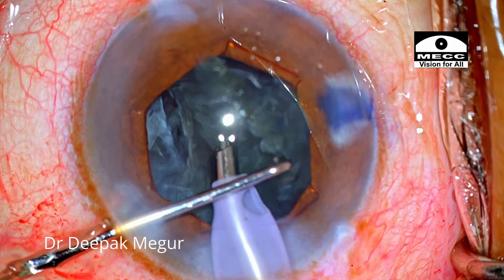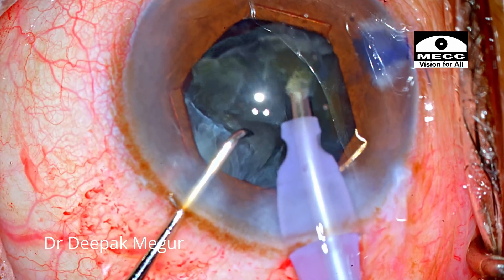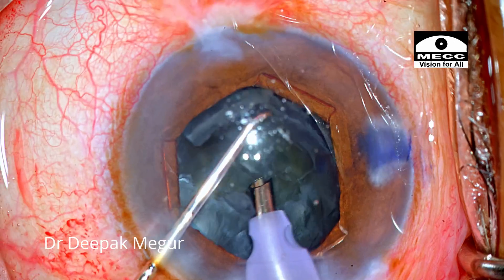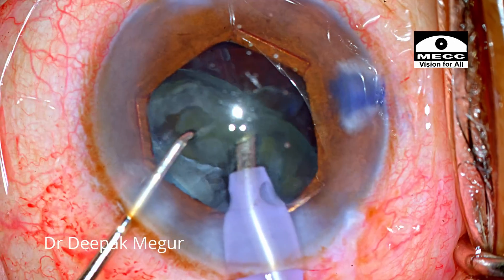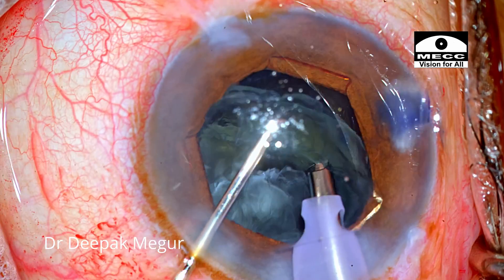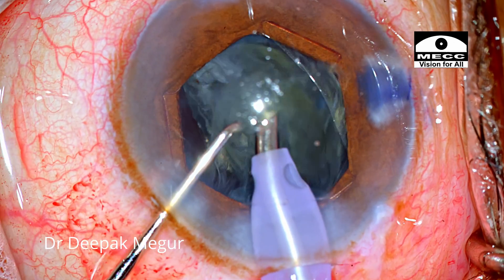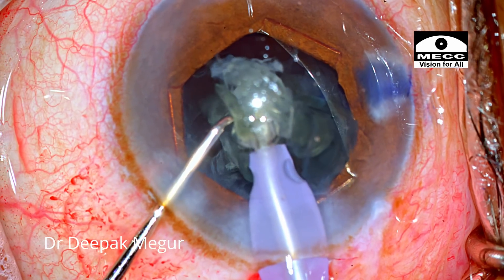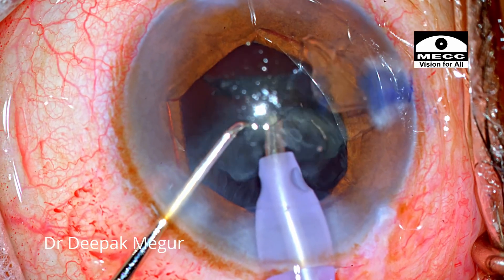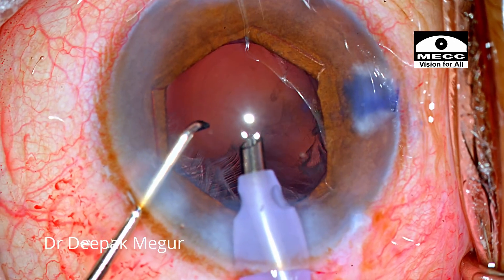The real challenge with soft cataracts is during the early part — getting the initial chop and that first fragment out of the bag. Once you get one fragment out, it becomes easy. In this case the pupil was not very well dilated, but what worked for me was an adequately large capsulorhexis and a good hydro procedure — the two most important things when dealing with soft cataracts in a sticky situation. The remaining fragments and epinucleus are very easily emulsified.